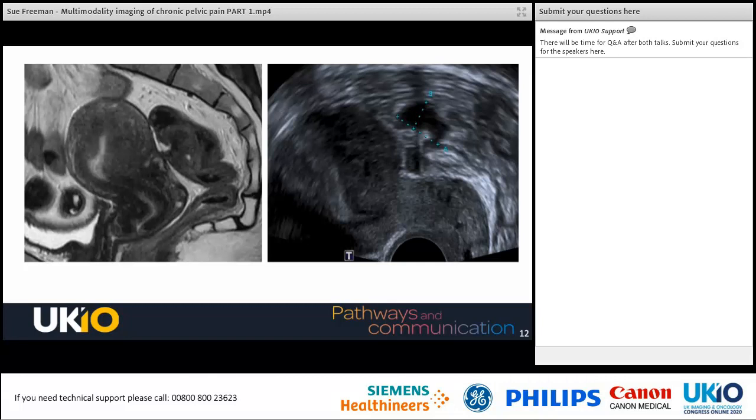Will this patient need just shaving of the lesion, a disc resection, or will she need a segmental bowel resection, which may ultimately involve needing a temporary stoma? All this information is really important, and we can plan accurately from the MRI.